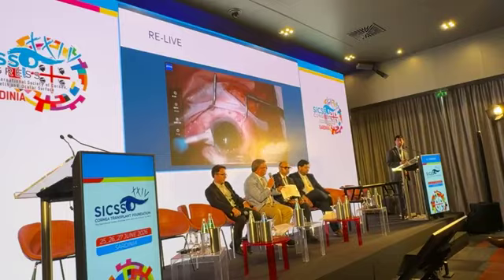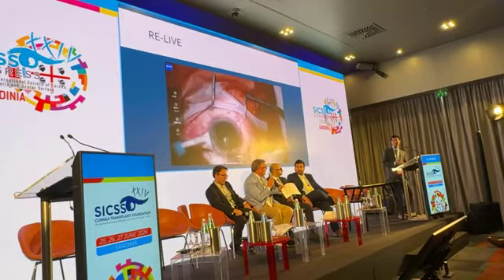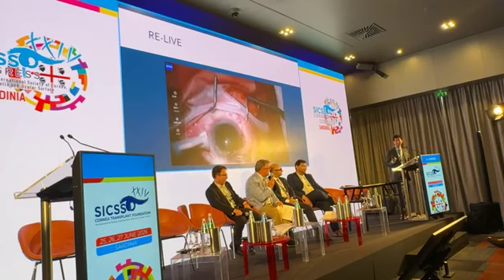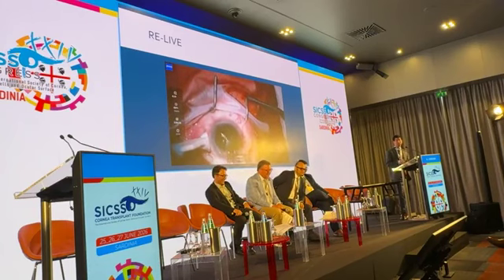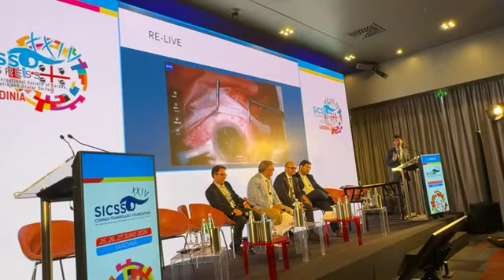Alan, have you noticed if the graft gets really, really dry and you get aggressive, you can tear the graft? That's why you always have to have it a little bit hydrated on the surface. Yep, I'm about to mention that in a little bit. I completely agree, because once I get the last of the wrinkles out, I actually do a pretty firm, slow pressure, because I've noticed that if you go too fast, I have torn one graft that way, because it was too dry, like you just mentioned.